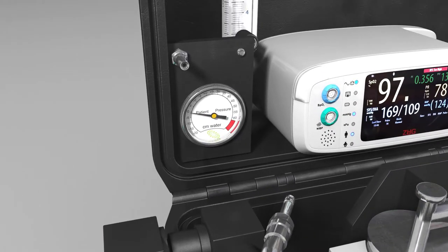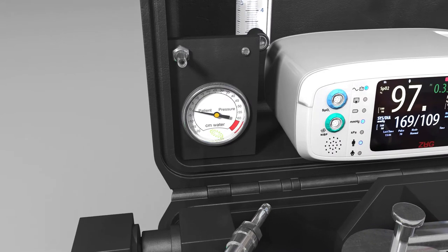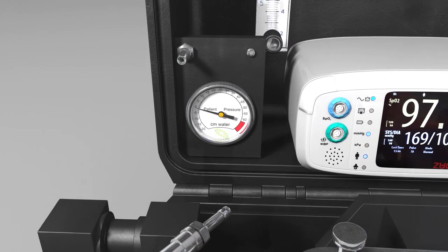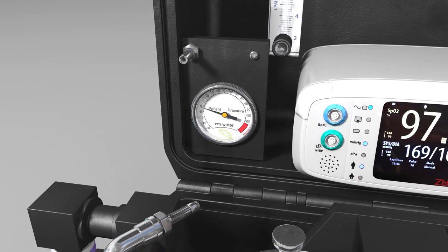The patient pressure gauge measures pressure generated by ventilation in centimetres of water pressure, either from the self-inflating bag or from a suitable connected ventilator. This gauge provides indication and control of the pressure being delivered to the patient.